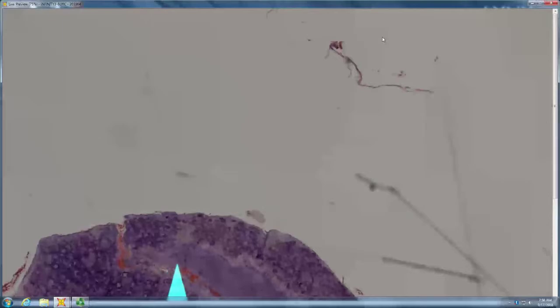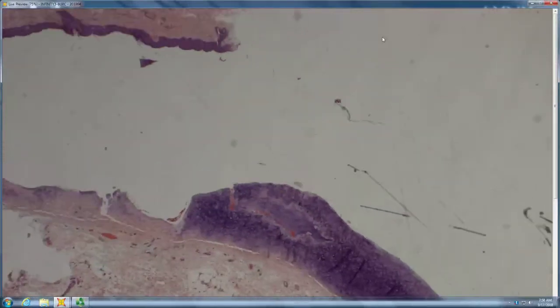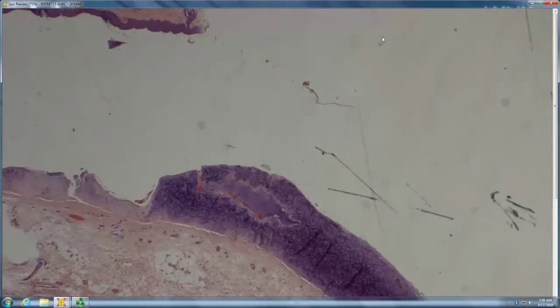Cartilage here. Happy cartilage? Not so happy cartilage. Why is it unhappy? Or in what way is it unhappy? It's not really inflamed, but kind of degenerated a little, in the middle. So what do you call it when your cartilage degenerates in the middle and kind of splits apart? Pseudocyst. That's it. So pseudocyst of the auricle.